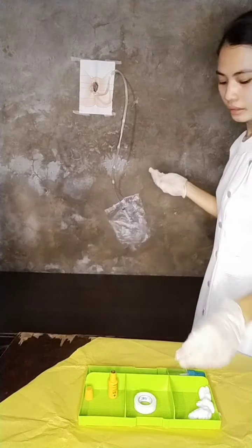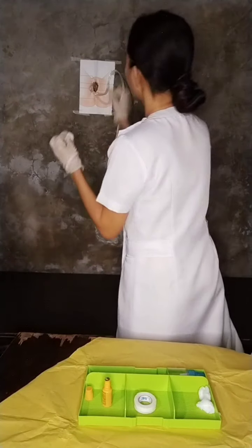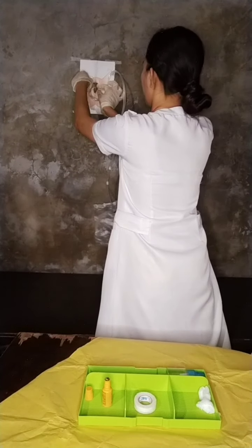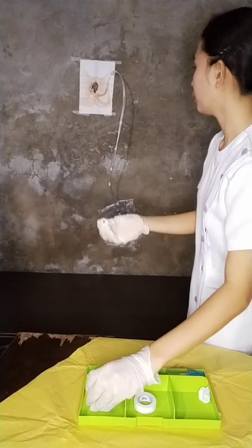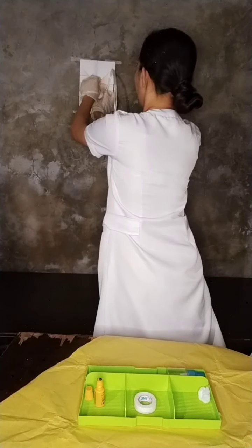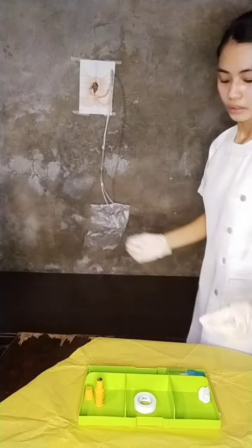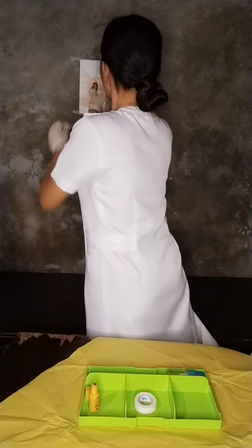And then after doing that, you need to repeat perineal care. So separate the labia and then wipe away from you, then discard. And then next, separate the labia using your non-dominant hand, and then wipe, and lastly to the meatus.